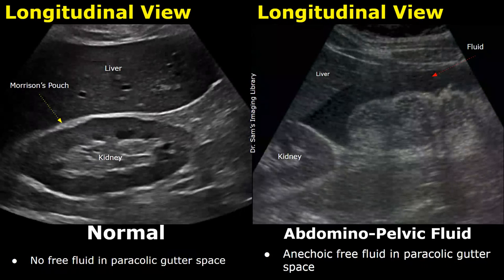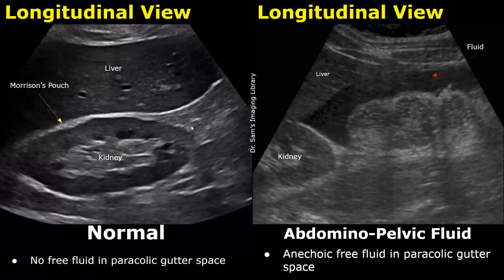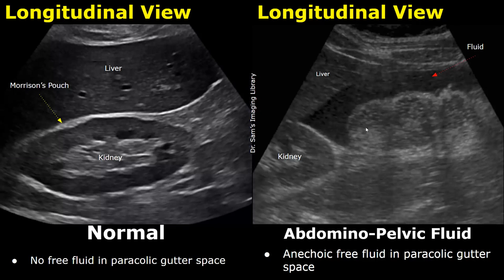Another important location to scan is the right paracolic gutter. This space is below the inferior pole of the right kidney and the inferior margin of the liver. Free fluid may be found in this location in some cases. In the normal case, no free fluid is found — we do not see any anechoic fluid. In this image, there is anechoic free fluid in the paracolic gutter space, between the bowels. This is another location where fluid can be found without fluid being seen in Morrison's pouch.